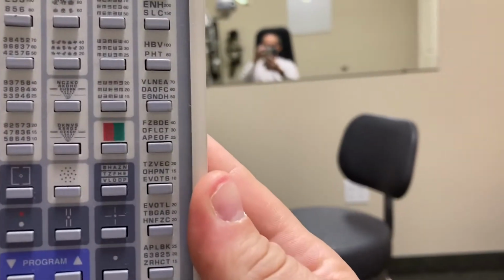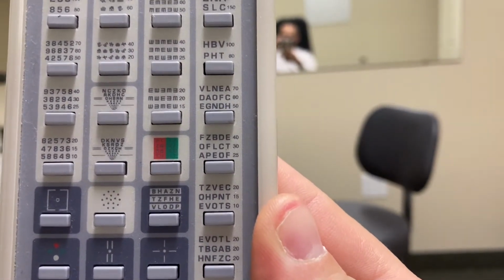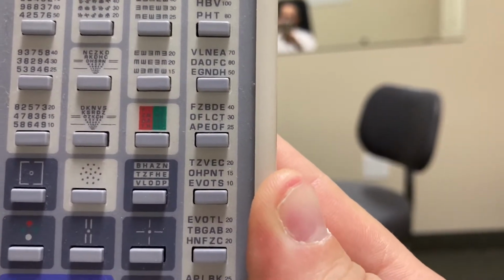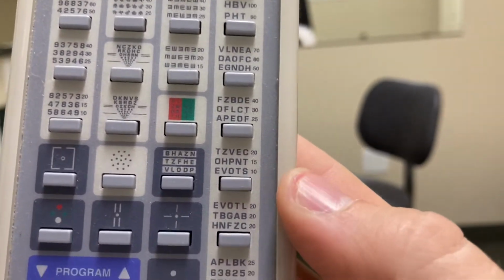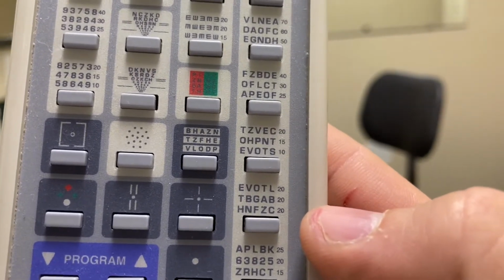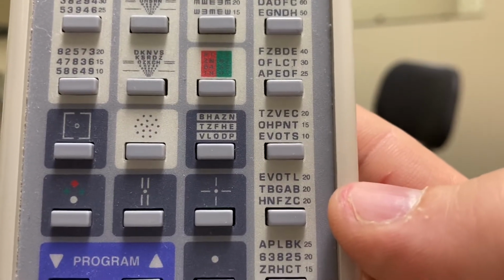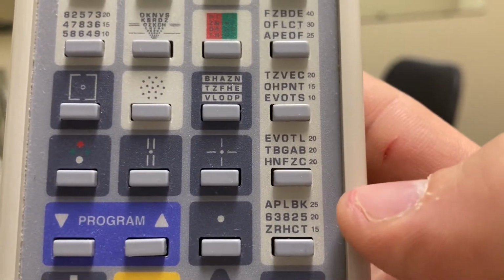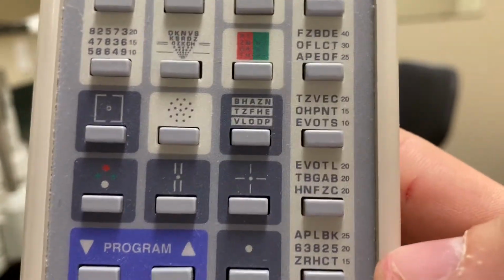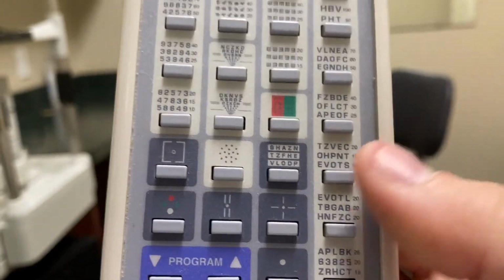And what I like on the Snellens is once they get down to the original 70, 60, 50, 40, 30, 25, 20, it goes down to 15 and 10, but then it gives you 3 more options of 20/20, so you can keep changing the 20/20 row on them, and they don't know which one you're picking. And they got a whole nother one that's 25, 20, 15. This gives you 5 rows of 20/20 that they never know which one you're on, and I like to have that variety.